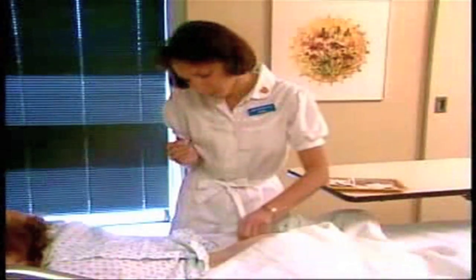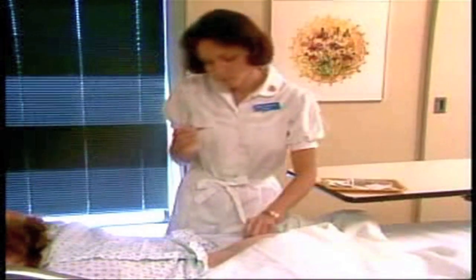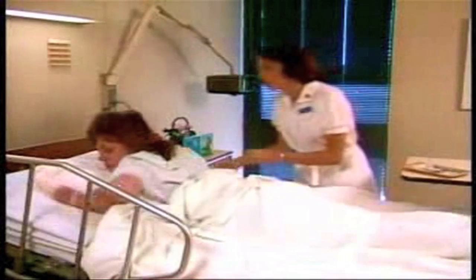Massaging the site is not recommended when slow absorption of the medication is desired or if it is irritating to the tissues. Place the needle into a puncture-resistant container. If any blood appears at the injection site, apply a Band-Aid to the patient's skin. Be careful not to touch the blood with your fingers. Mrs. Dowd, we're all done now. You can turn over. Let me help you.